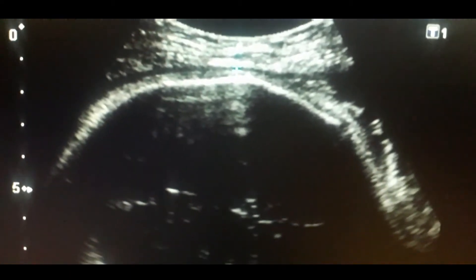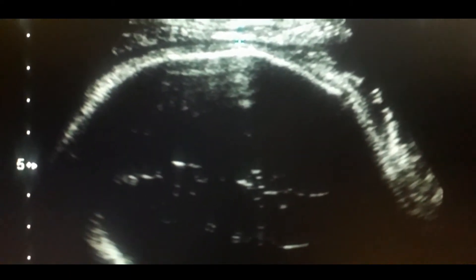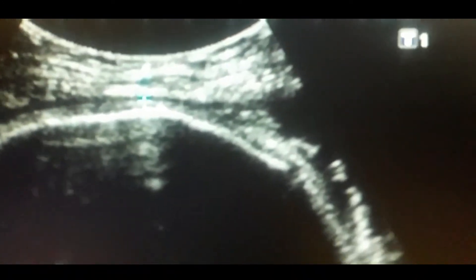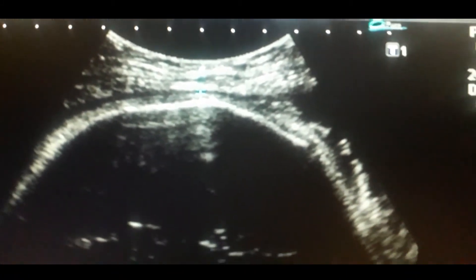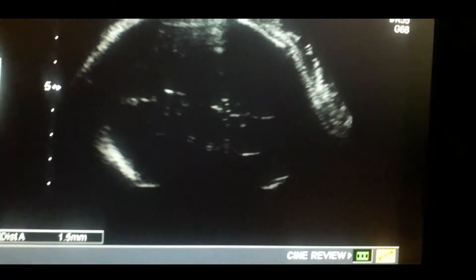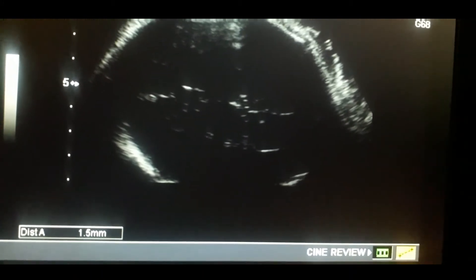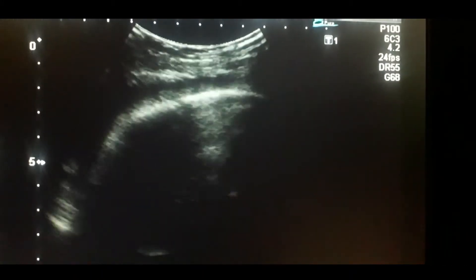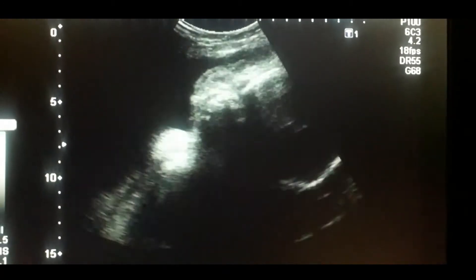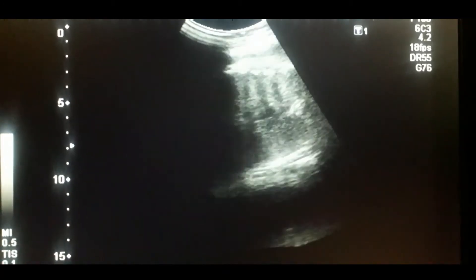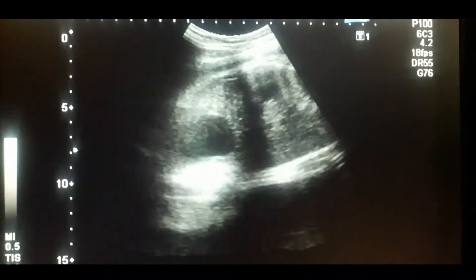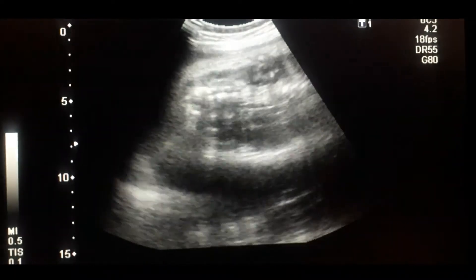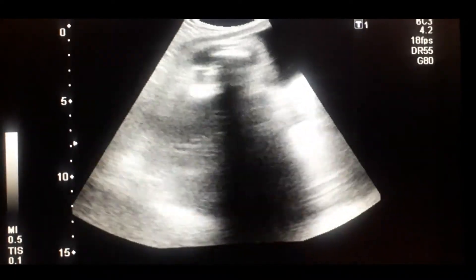If it is less than 3 millimeters, this creates pressure on the lower uterine segment. This is also an indication for C-section if the lady has had a previous section; otherwise there would be a chance of dehiscence of the lower uterine segment. This lady has quite a thin lower uterine scar.